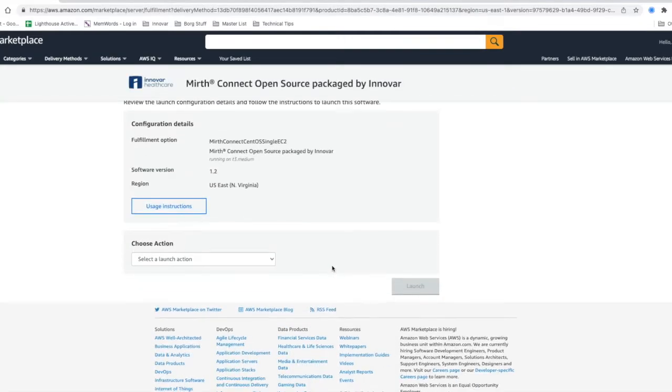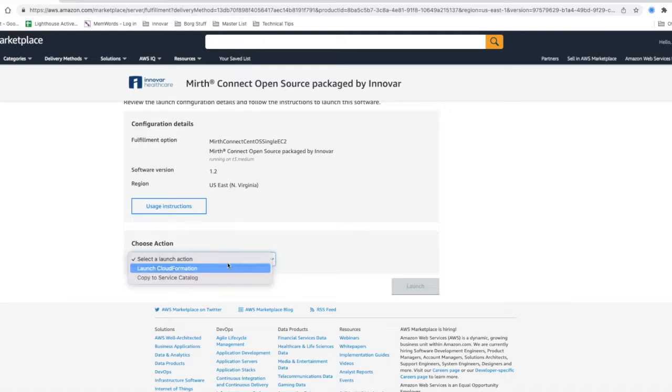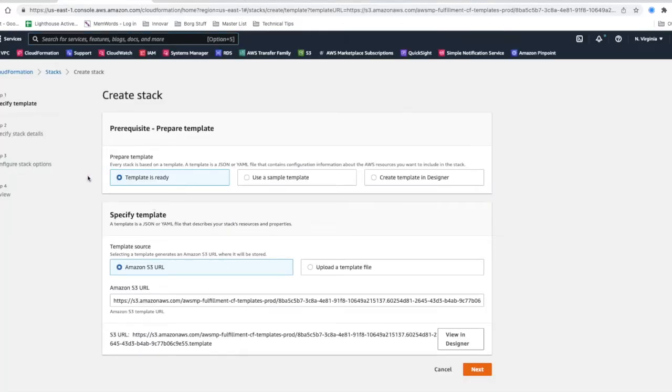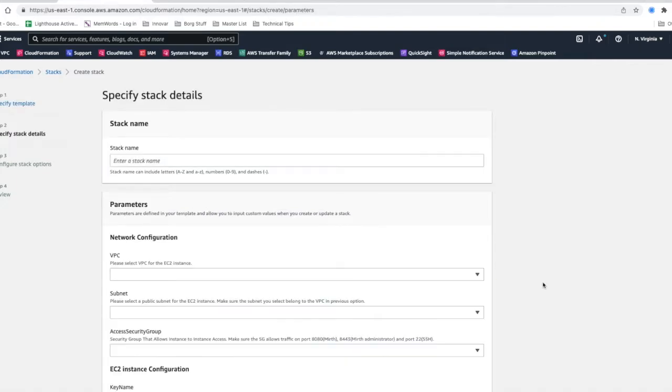From there, launch cloud formation and then launch. Then you can see we have everything already filled out here. You just use the template is ready, your template source is next.